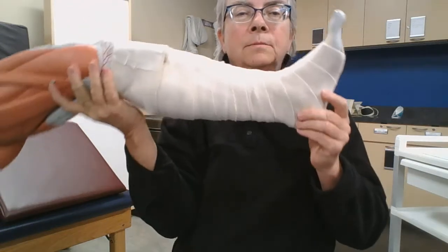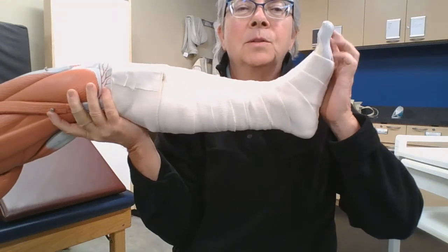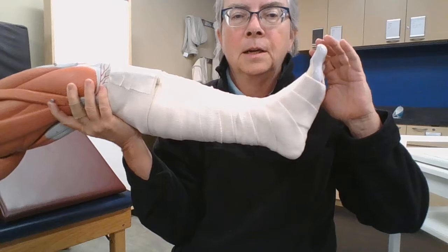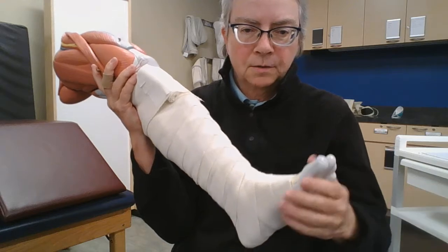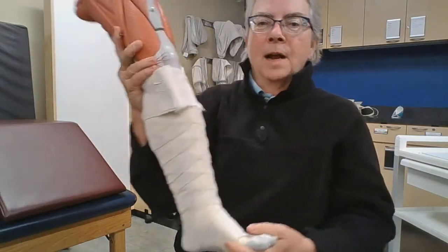We also do an ACE wrap in neutral, okay? We don't want to be in either a really dorsiflex position or a plantar flex position, okay? We want to ACE wrap them in neutral, okay? So that's that.